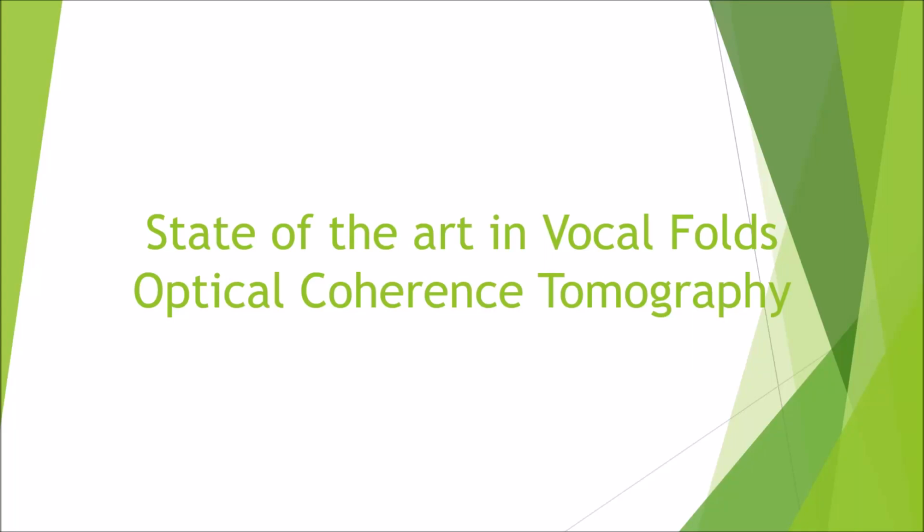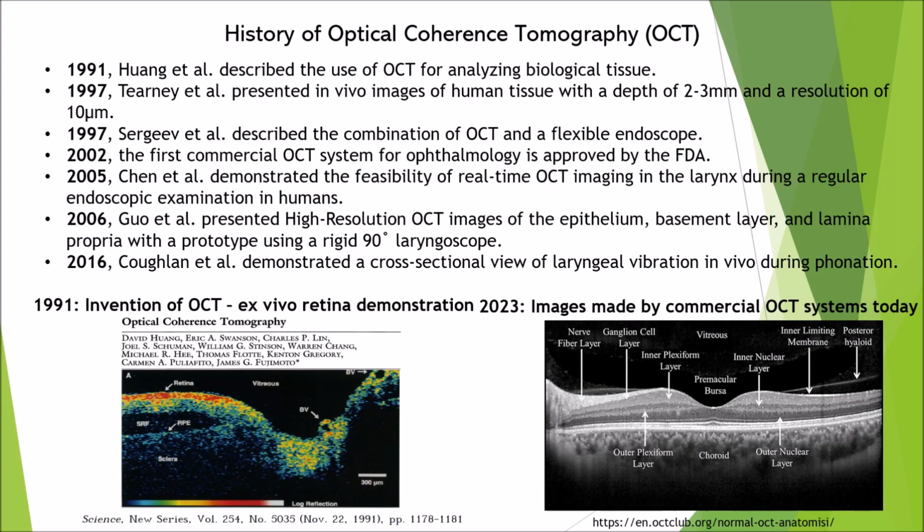Hello and welcome to today's episode on the state of the art in vocal folds optical coherence tomography, based on an earlier presentation. OCT for analyzing biological tissue started in 1991, and since then there has been a development where, by far, the area of eye research is in front.